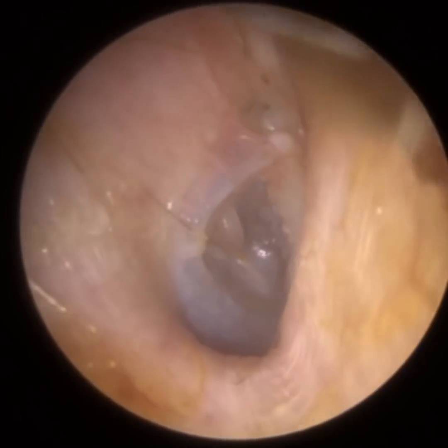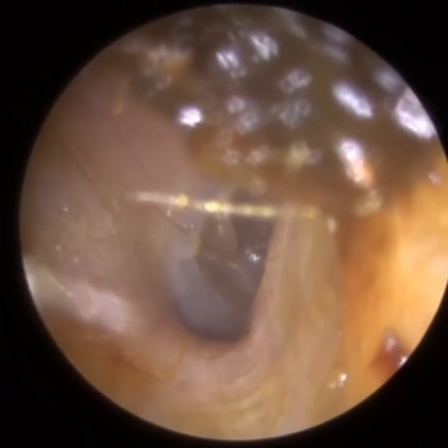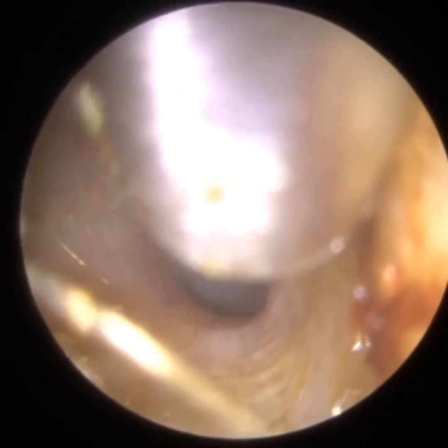There's the grommet — the blue grommet, the ventilation tube. So it's the function of the eustachian tube to equalise the air pressure behind the eardrum in the middle ear to that of the atmosphere. This is the patient's right eardrum. You can see it's a very bendy, narrow, twisty ear canal, and the patient has got a posterior retraction — the eardrum is wrapped around the long process of the incus.